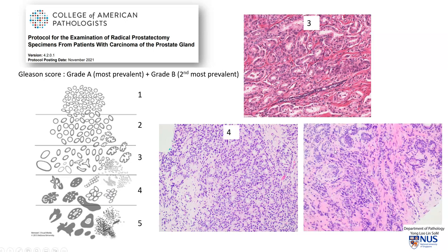In yet another case, we can see some benign bilayered prostatic glands, but where the tumor is, there is no gland formation. Instead, we see some cords of malignant cells. This falls into Gleason grade 5. So for example, if the most prevalent area is grade 3 and the second most prevalent area is grade 5, then the Gleason score would be 3 plus 5 equals 8. Gleason score is a very important prognostic feature in prostatic adenocarcinoma — the higher the score, the worse the prognosis.